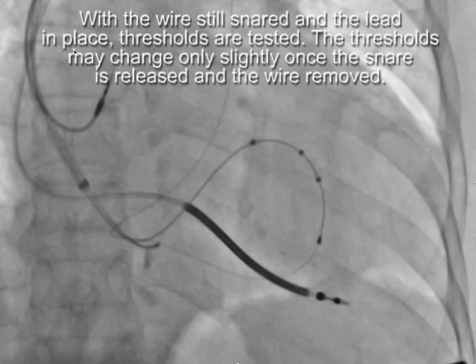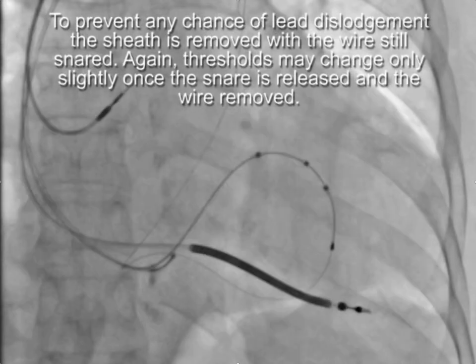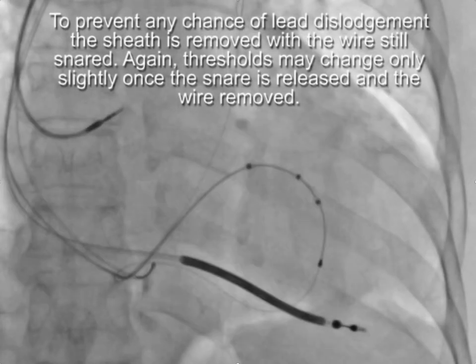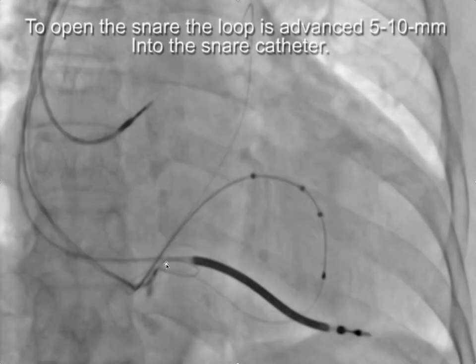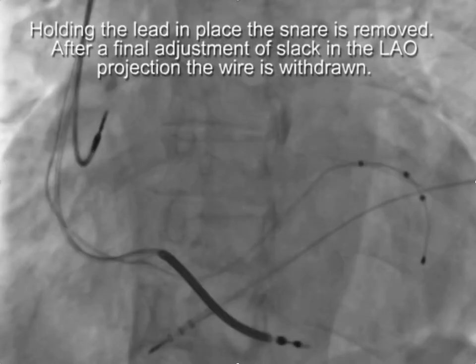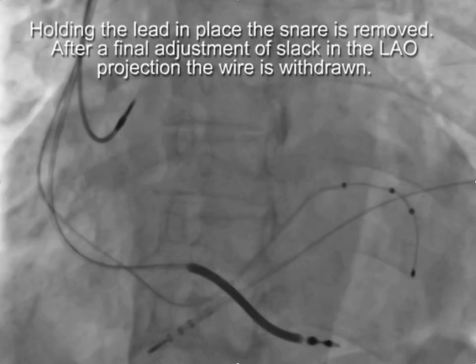Once the wire is snared and the lead is in place, thresholds are tested. Thresholds can change slightly once the wire is removed, but phrenic pacing doesn't change. To prevent any chance of lead displacement once the sheath is removed, peel the sheath away first. Then once the sheath is removed, open the snare — the snare is now open, so you can put traction on the wire since it's no longer captured. The wire pulls back into the pacing lead. Then, while holding the lead in place, remove the snare and apply your final adjustments.